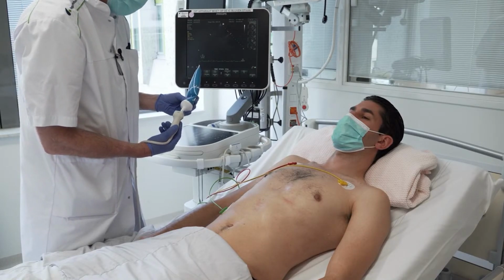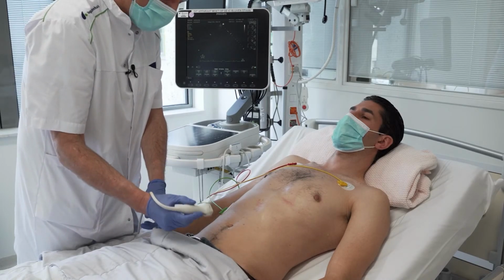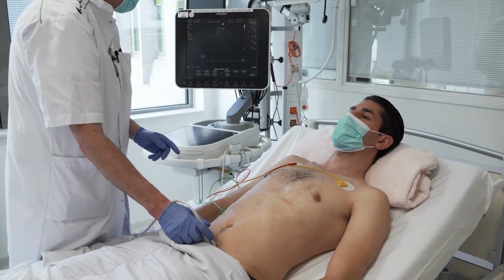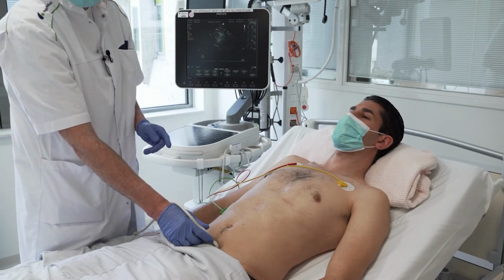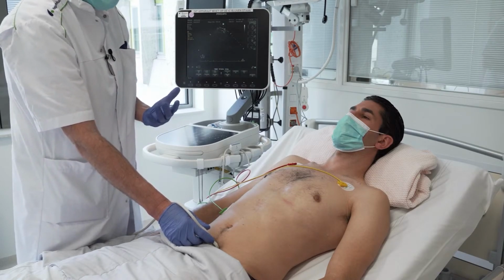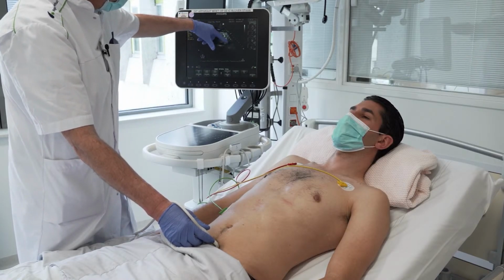Then we go to the lower abdominal view, and we do a transverse location. This is a suprapubic view. Preferably the patient has a full bladder, so you don't want to catheterize the patient. And you will see the bladder here like a balloon.